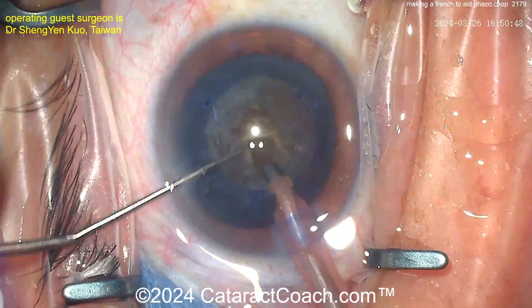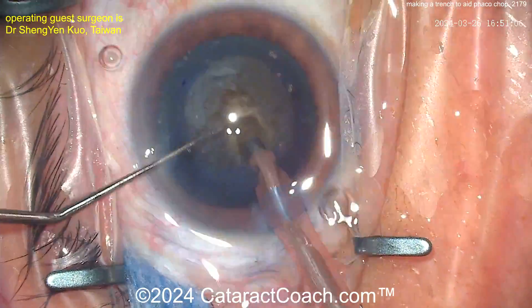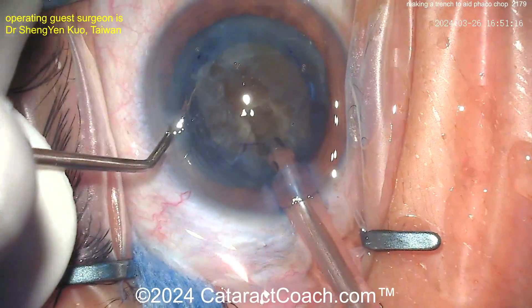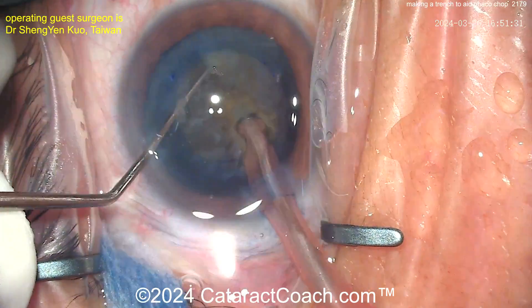Now the probe can be placed deep in that pit, and you can get the chopper on the other side of the nucleus — the chopper can go around the lens equator. There's that deep pit. This basically allows you to trap the nucleus between that sharp ledge and your chopper on the other side, so you can put a lot more force and get a much better chop.